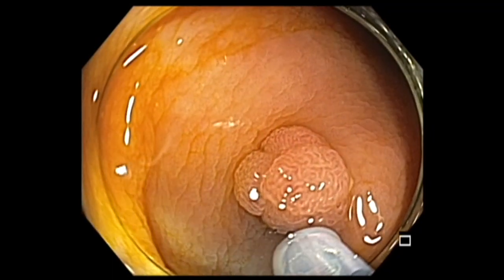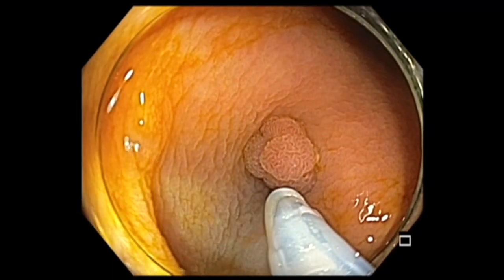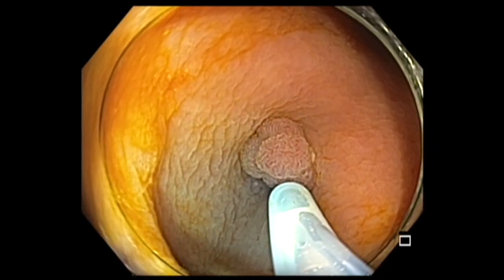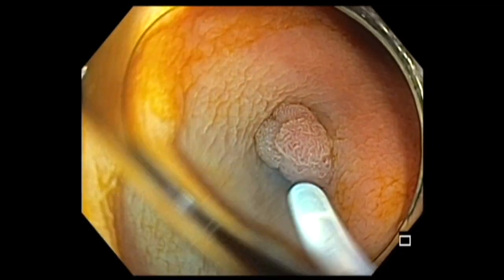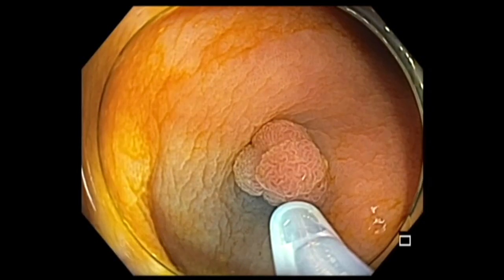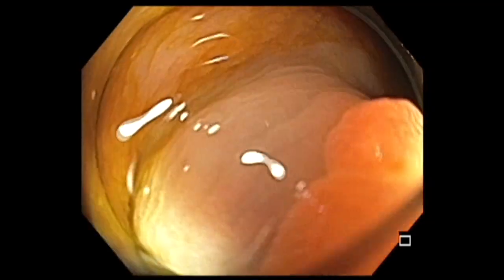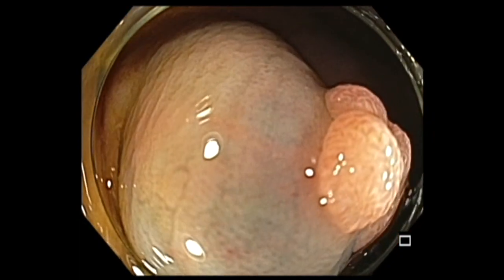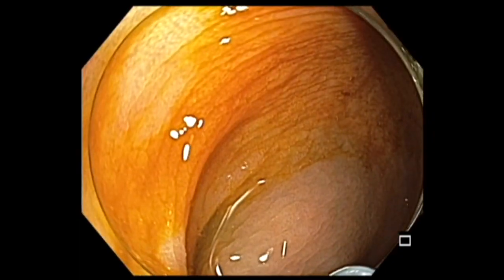In this case, I decided to inject saline with a little bit of indigo carmine to lift the lesion. And once the lesion has been lifted, I used Endocut-Q 313 to cut this polyp. Now you are seeing the injection.